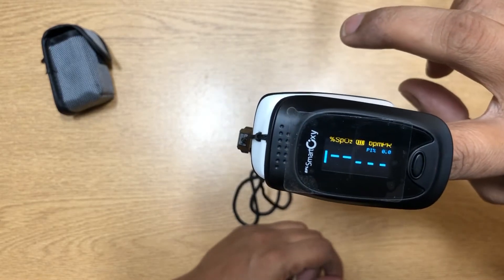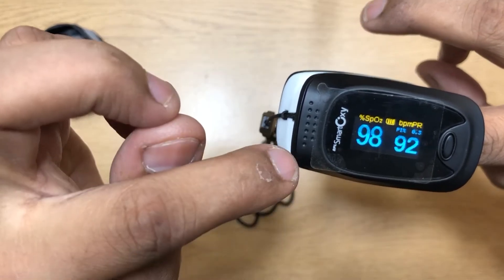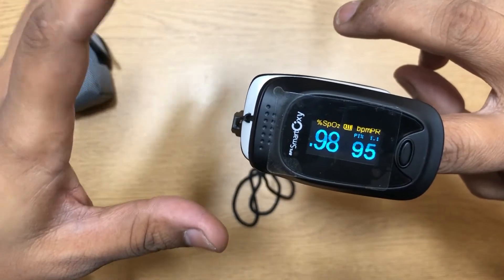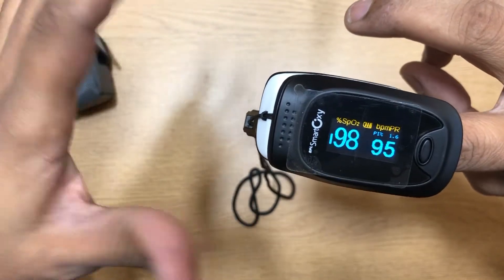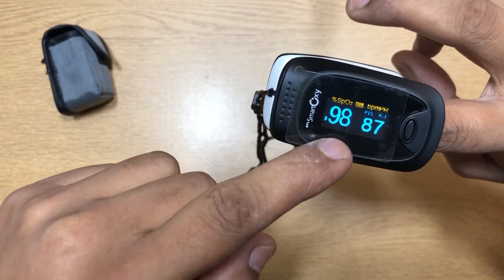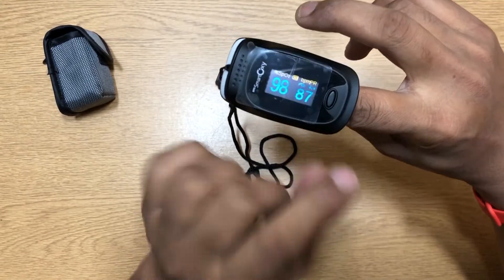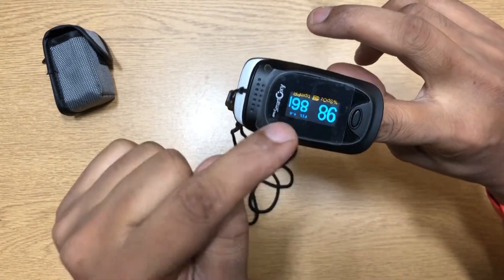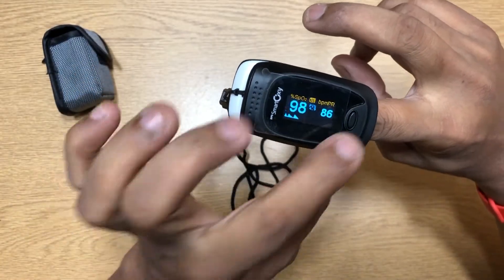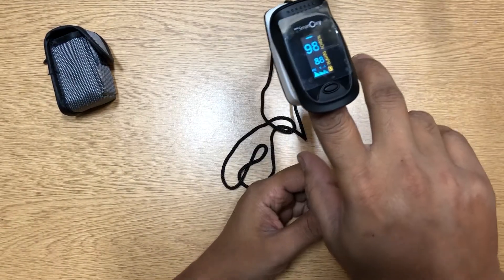It starts monitoring your heart rate and oxygen percentage. It says 98% oxygen, and my heart rate is 86. Most of the time you'll get between 97 and 100 — it keeps moving between those values. If I want to change the orientation while it's on, I just press the button once. The orientation changes for different sides — you can even keep it sideways.